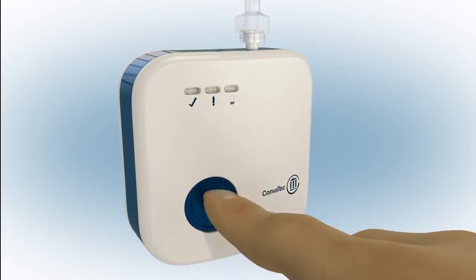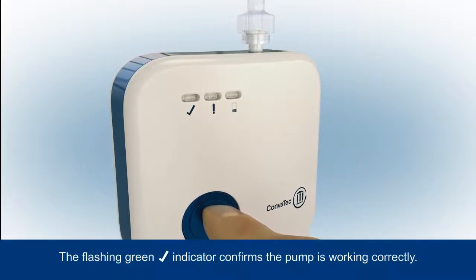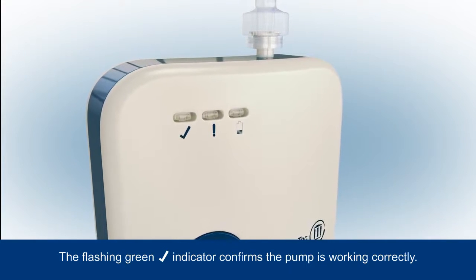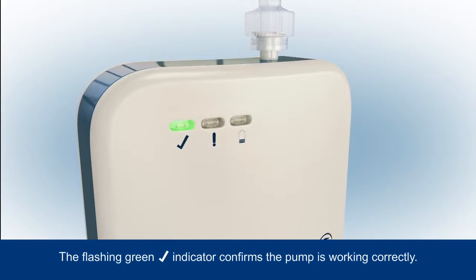Press the blue button at the front of the pump for 3 seconds to commence negative pressure. The green tick indicator will start to flash to tell you the pump is working correctly, and will continue to flash regularly to indicate that the system is turned on and functioning properly.